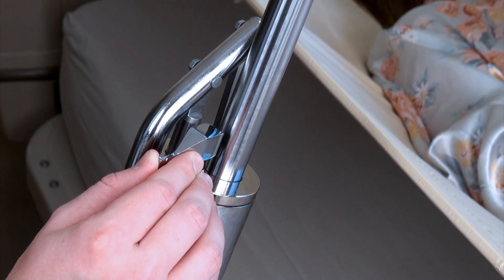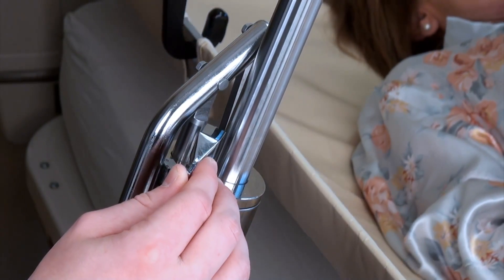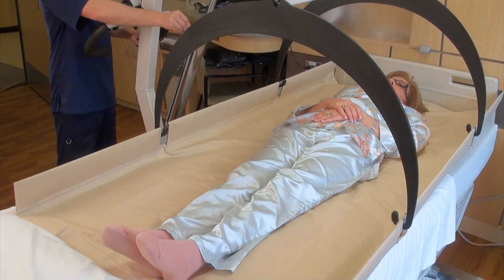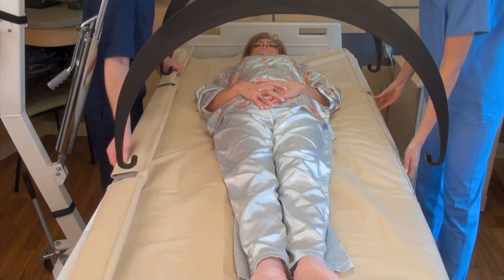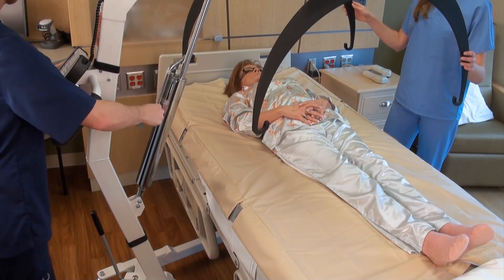Once the weight has been measured, lower the patient slowly to the bed by opening the release valve. When the patient is back on the bed, detach the stretcher support bars from the support hoops and raise the arm so that the hoops are clear and away from the patient.